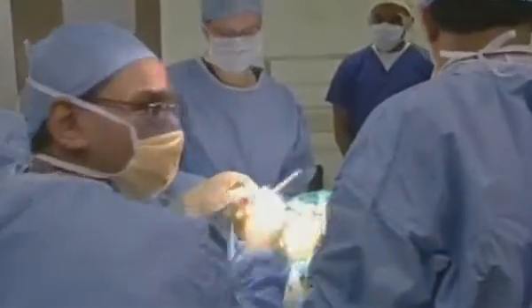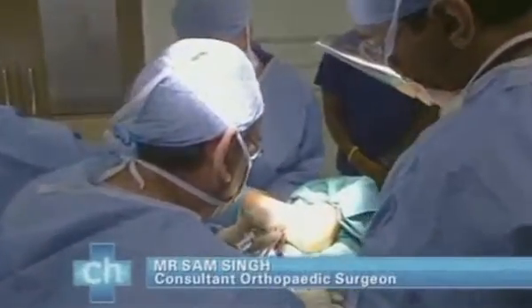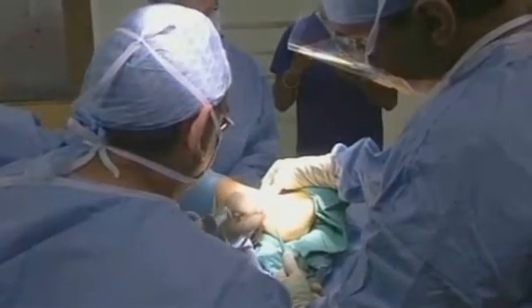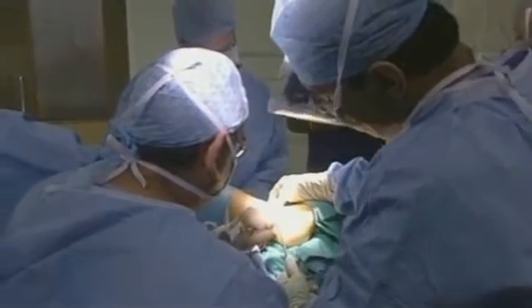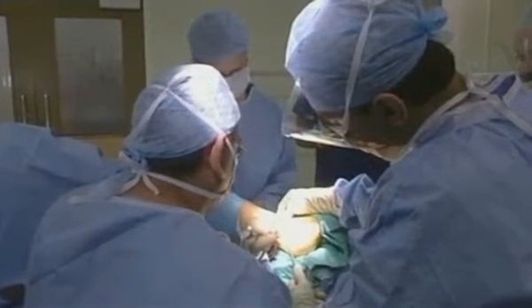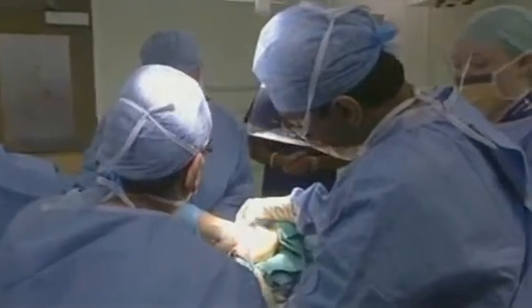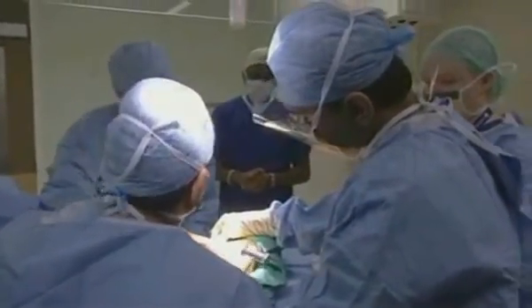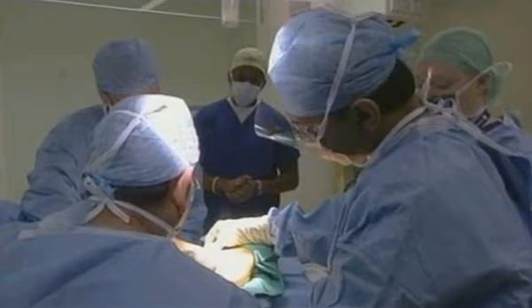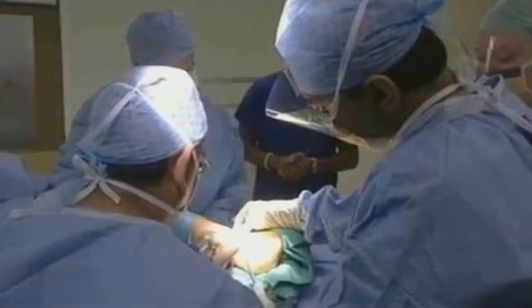Now we're going to use a very simple instrument called a bone tamp, which is just used for pushing bone. And we just do it very gently, we just push that in. And so at the moment you're pushing the... Just pushing that little window I made gently into the bone. And the nice thing is it's still covered by all the periosteum, which is a good source of healing, and it gives a soft surface. If I just took the bone away, then it would be very rough, and it could cause further damage to the tendon. So what we're doing at the moment is just pushing this in. Now, it's very slowly because obviously we've cut the bone and we can cause a fracture, so we have to be very gentle here. Just slowly work our way in.